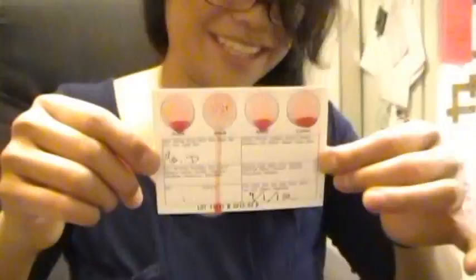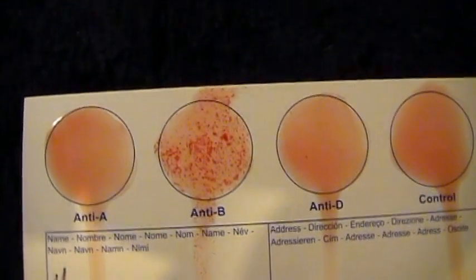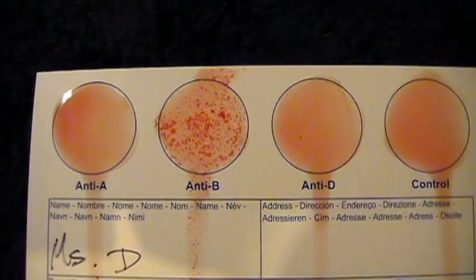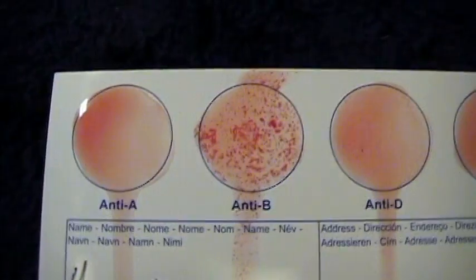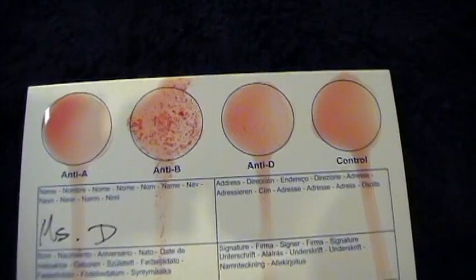It looks like I would be B negative. However, I know I'm B positive — that's what my mom tells me. Yeah, you could see it. It's very weak, the agglutinate, but it's there. So I am B positive, after being stuck three times.